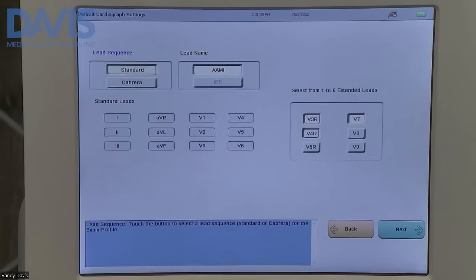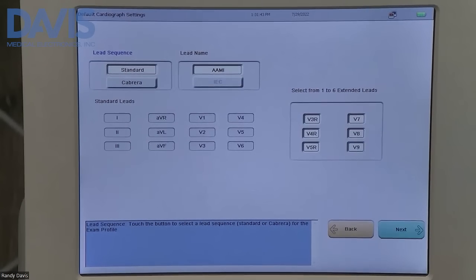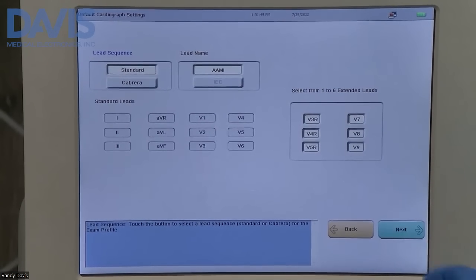From this screen, you're going to select all the additional leads, then select next.